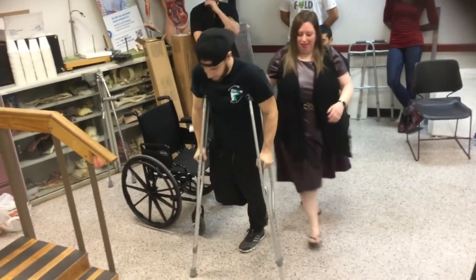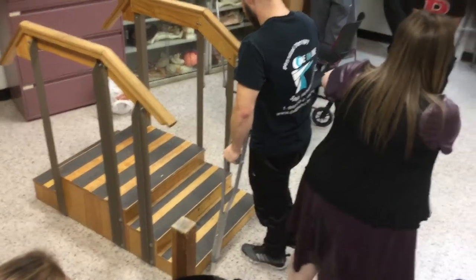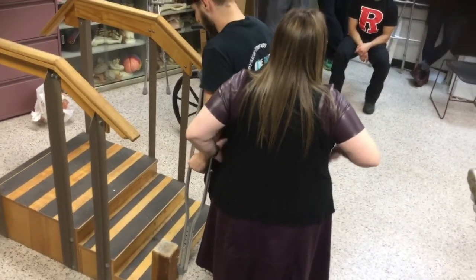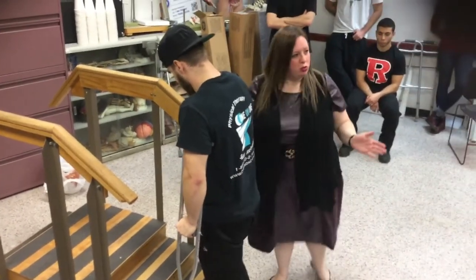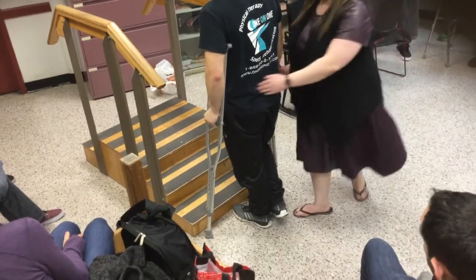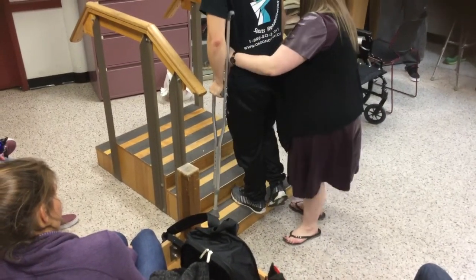Here comes the fun part — the stairs. This is the only time the routine changes. Usually, we said the device goes up before the affected leg. However, with axillary crutches, because it goes so high, if he were to put these first, you see how that elevates the shoulder? You don't have any momentum or any good base of support to jump. So this is the only time when you hop before the crutches go up. Which, in truth, doesn't change the consistency because it's always the good leg then the device. So the good leg is what's going up. We're going to hop with the left leg — a small hop just to clear the step, onto the step. Then crutches. Another hop. Crutches. Hop. Crutches.